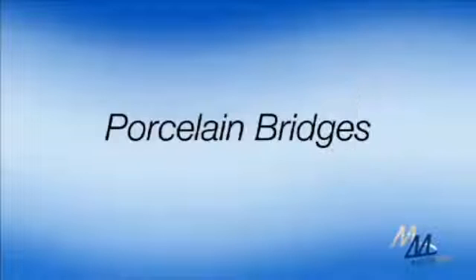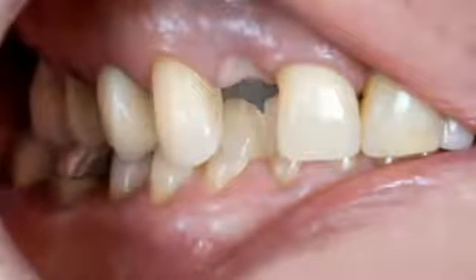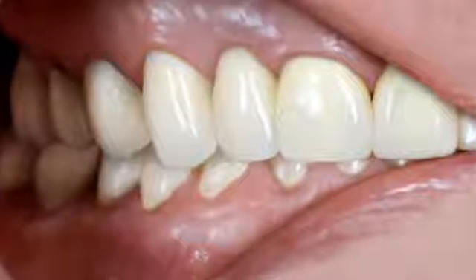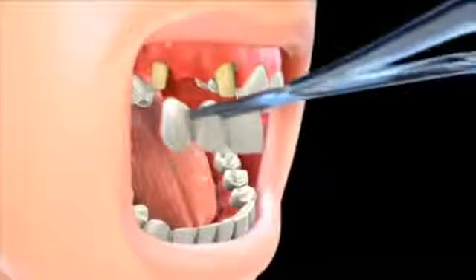All porcelain bridges are generally considered the most aesthetic choice, since they closely resemble the color and appearance of your teeth. However, all porcelain bridges tend to be more fragile compared to other bridges. Porcelain bridges are most widely used to replace missing teeth in the front of the mouth.